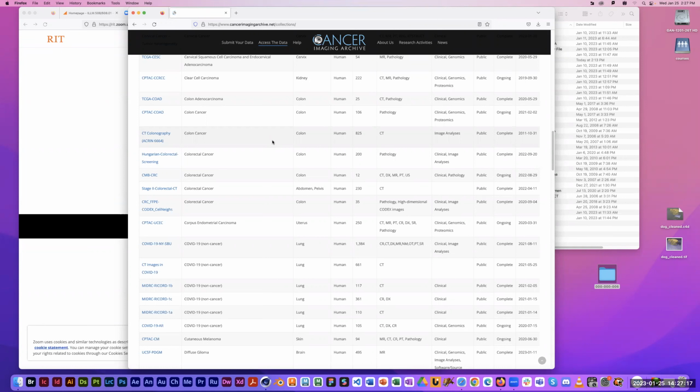And you could do that on your own personal computer. But I have a feeling when we get to that step here, because of RIT's security, it may not let us install the app that we need to download it. So I'm showing you this in case you want to do this at home, but just beware, there's a really good chance that we won't actually be able to retrieve any of this here.